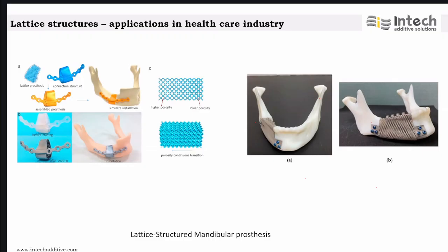It's about the combination of 2 and 1. So if the combination is 2 and 1, it actually shows gradient lattices, where pore size and density changes across the implant, which is tailored to stiffness and also promotes bone growth.